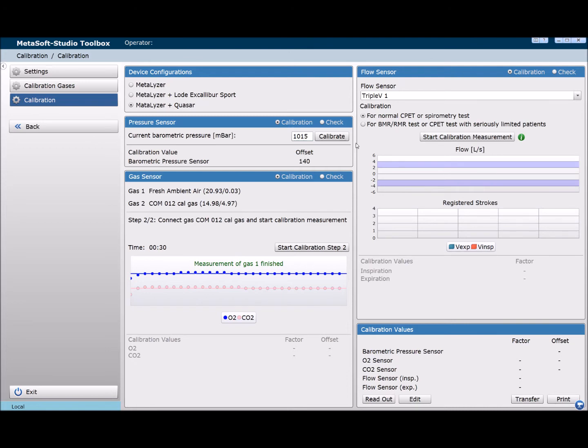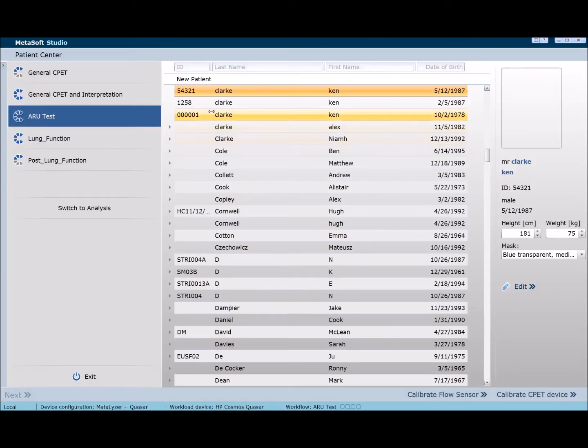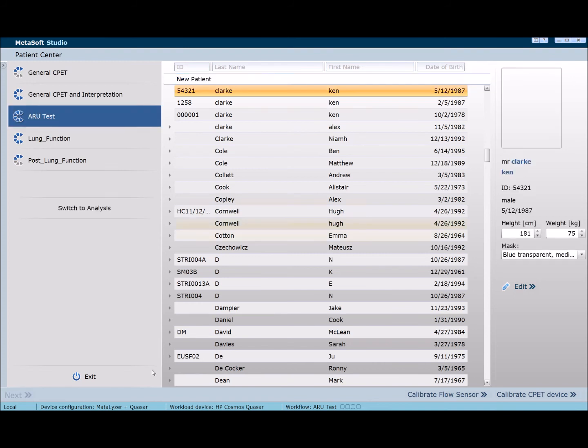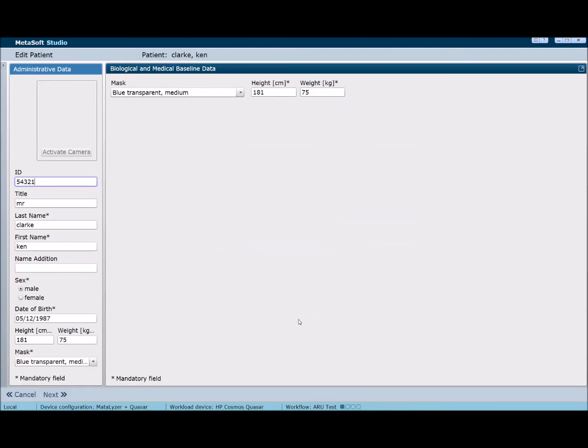Click on new patient or scroll to an existing patient, then click next. Enter the patient's details and ensure to update their height and weight for every test, then click next to choose or create your protocol. Once the protocol has been chosen, click sensor adjustment, which takes approximately a minute to complete.